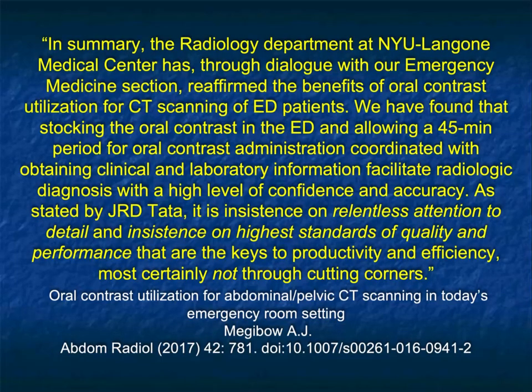We explain to them the benefits of oral contrast in the ED, and we find that they're happy with it. And again, as stated by Tata, it is insistence on relentless attention to detail and insistence on highest standards of quality and performance that are the keys to productivity and efficiency, most certainly not cutting corners.